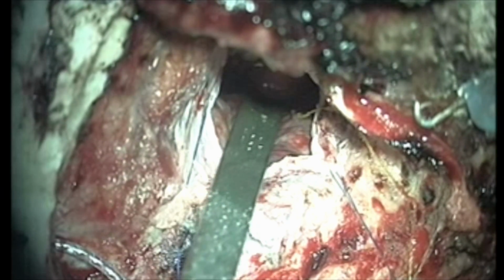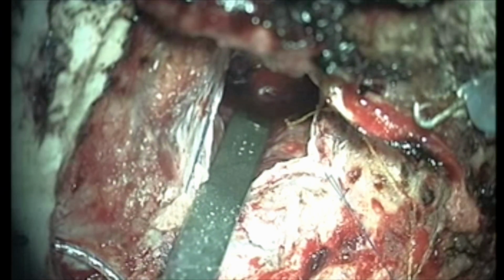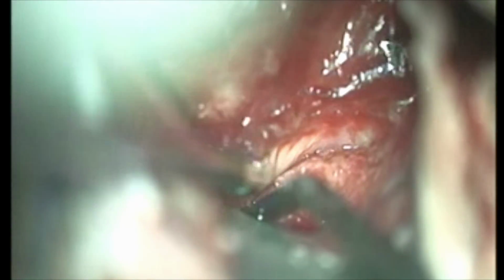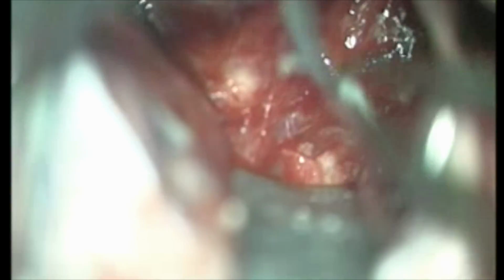Okay, so in this case, there's been a big amount of bone removed from behind the ear to get access to remove the vestibular schwannoma, and the tumor's been removed. And this is the brain stem here, and this is the back part of the brain called the cerebellum. So we push the back part of the brain down, and this is that whiter area that you saw, the cochlear nucleus, and that is the electrode being slid into the little hole adjacent to the cochlear nucleus. And those little electrodes then stimulate different areas of the surface of the cochlear nucleus. Okay, next one, please.